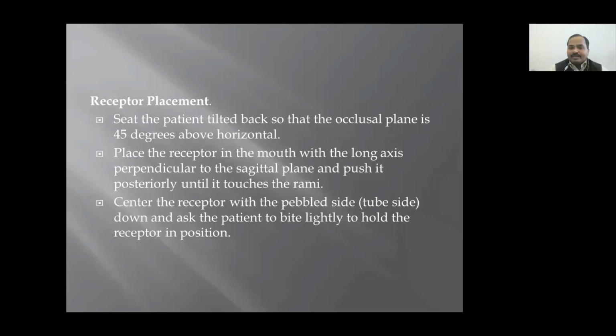Whenever the patient is stabilizing with fingers, it is always indicated that the fingers do not come in the path of the central ray. Otherwise, what will happen? The fingers or the bones will also be radiographed. That will come as an artifact.